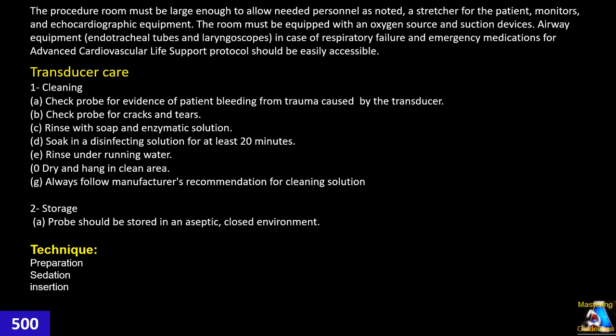Each facility and department has its own specific rules for taking care of the transducer: how you handle it, how you clean it, how you make it sterile, and how you store it. Go follow the rules of your facility. I'm not going to talk about that. There are some general rules.